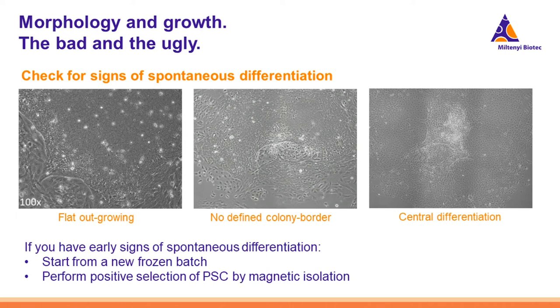If the cells are cultured under suboptimal conditions, exposed to environmental stress, or if the line is not of good quality, PSCs may undergo unwanted spontaneous differentiation. The most common signs of alteration in PSC morphology include flat outgrowths of large cells, colonies with poorly defined borders, and central differentiation with loss of monolayer growth.